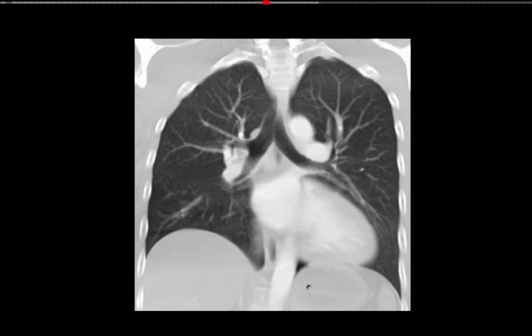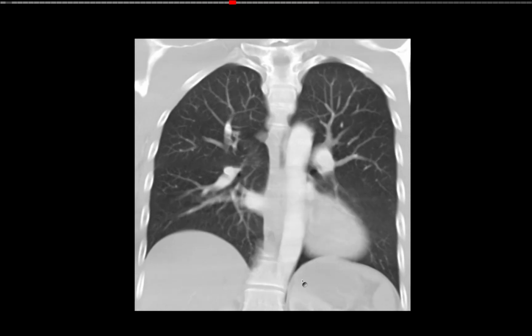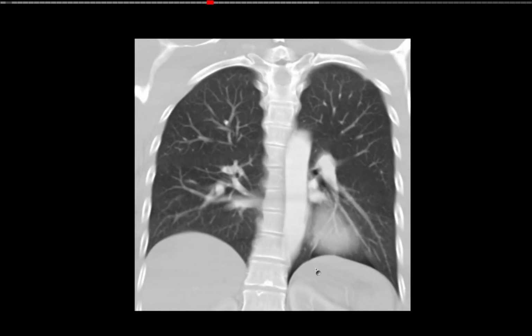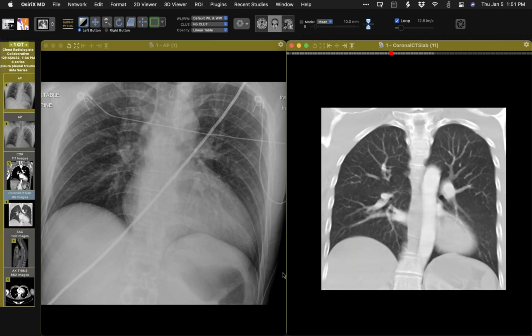I don't know if this is a real anatomic name, but just for descriptive purposes, I sometimes use the word phreno-aortic recess, as if the air has created a little recess there. It's just purely description. But that's the anatomy of the air that we see. It's in this location, it's para-aortic, and you can see nicely its contact with the hemidiaphragm, making that very sharp interface. So just another place beyond this lateral costophrenic sulcus, deep sulcus, to look for air as well. And if you see that, it's confirmatory evidence, if you need it, that there's air there as well.